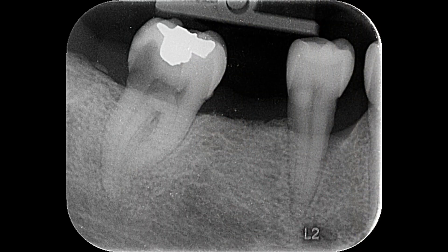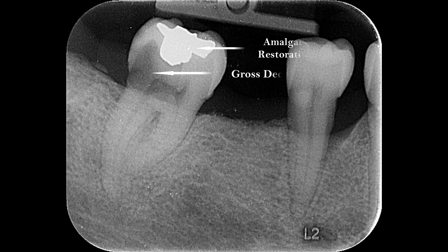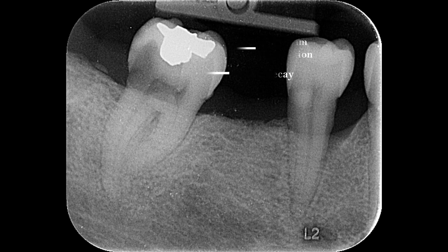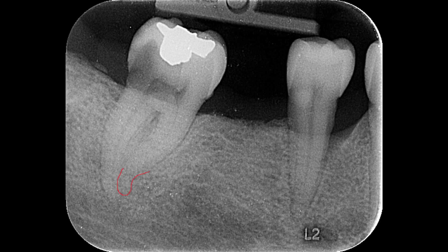This is the pre-operative radiograph of the patient. Even though the tooth is severely decayed, there is an amalgam restoration there, and below it there is a huge decay. There is also decay on the distal aspect of the tooth and on the buccal aspect. Most of the time dentists prefer to go for extraction of this tooth. There is a sharp curvature at the end of the mesial root, so we have to take care to prevent instrument separation.